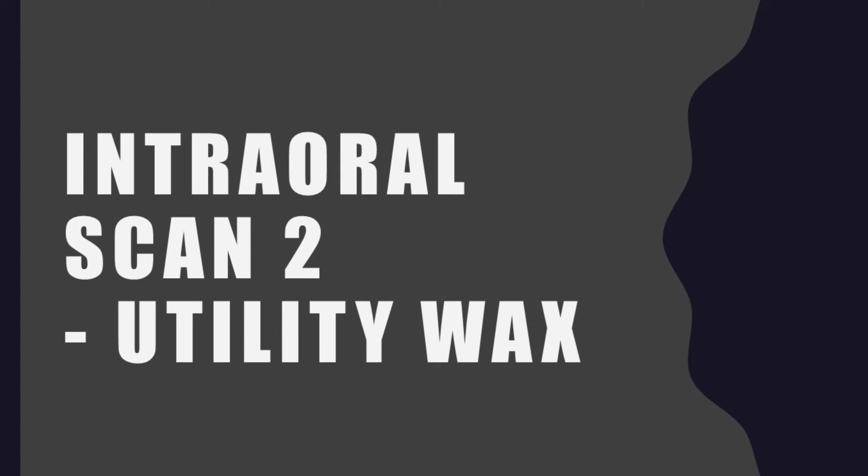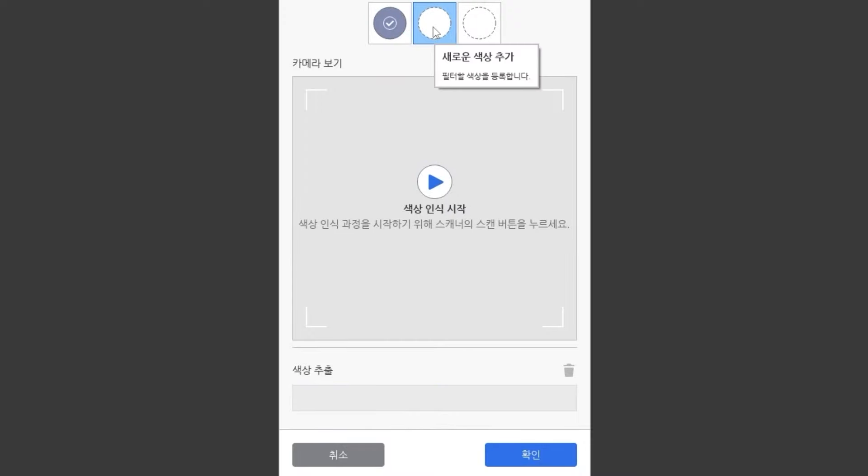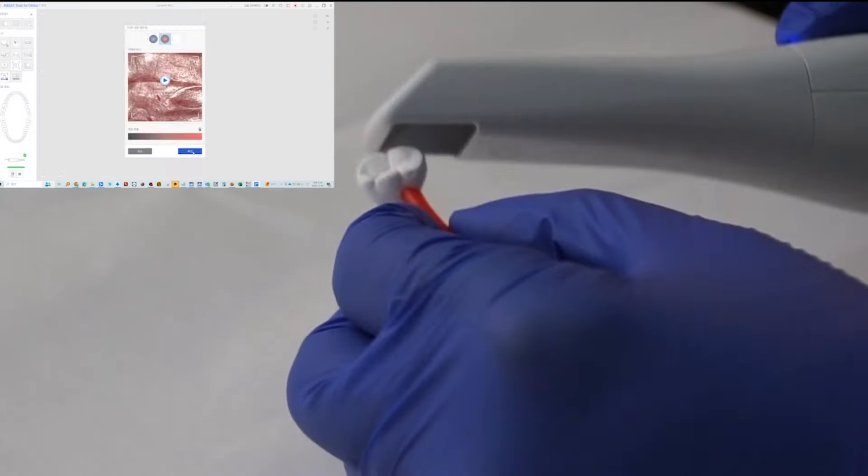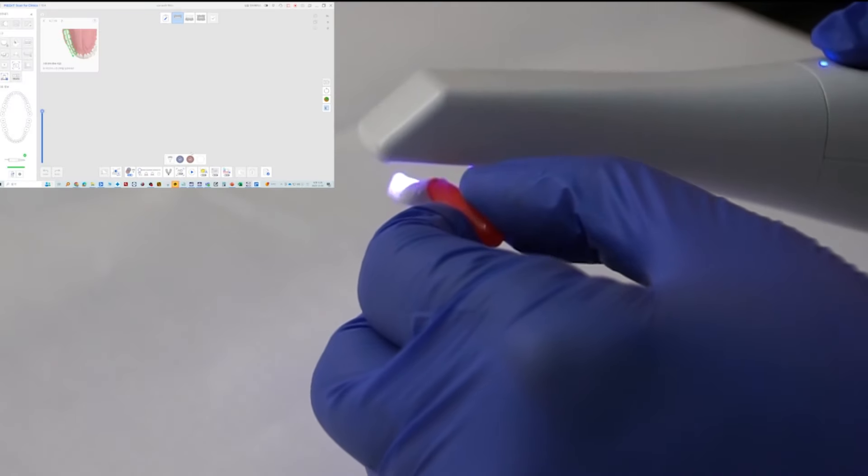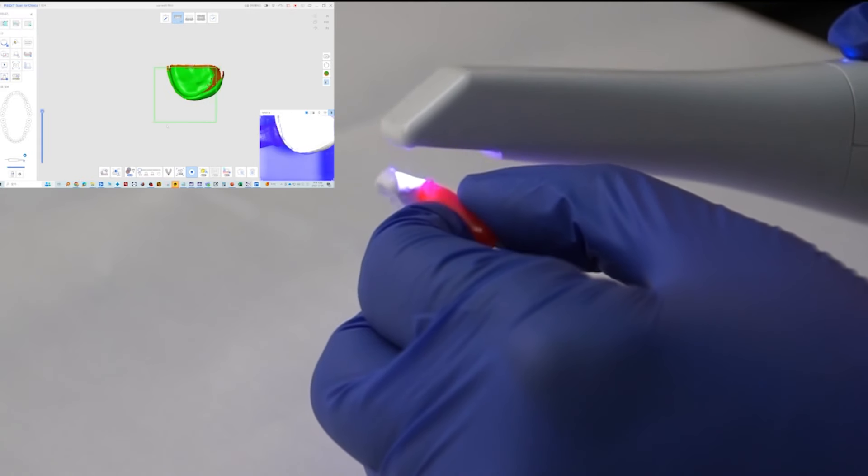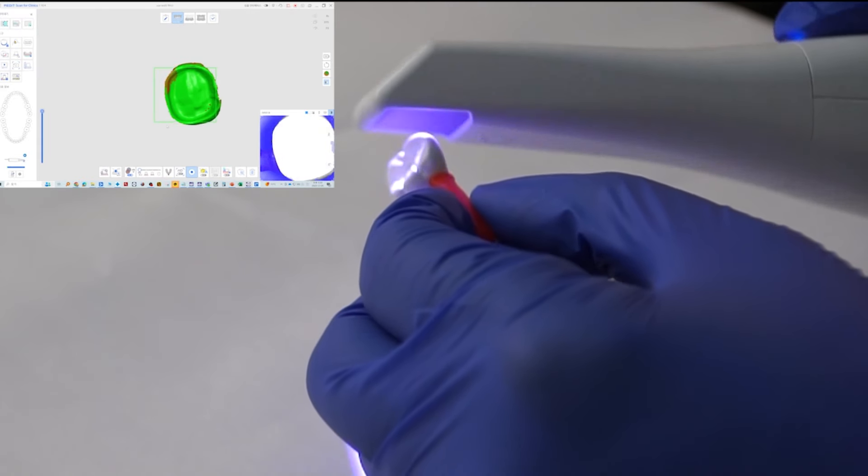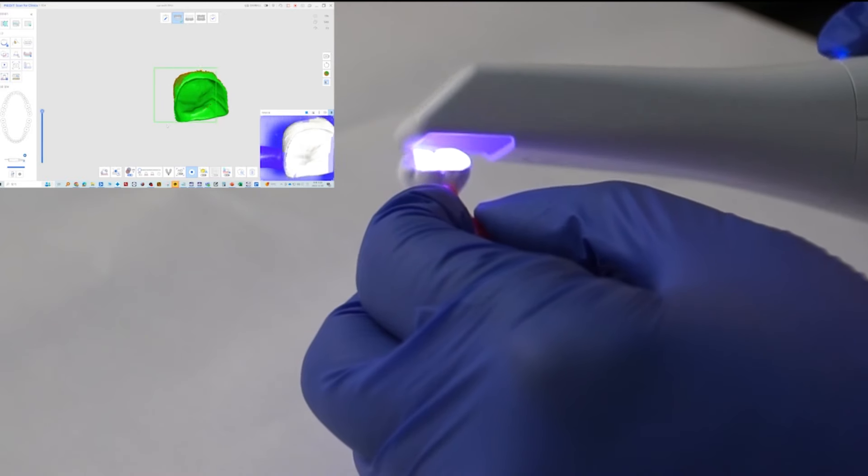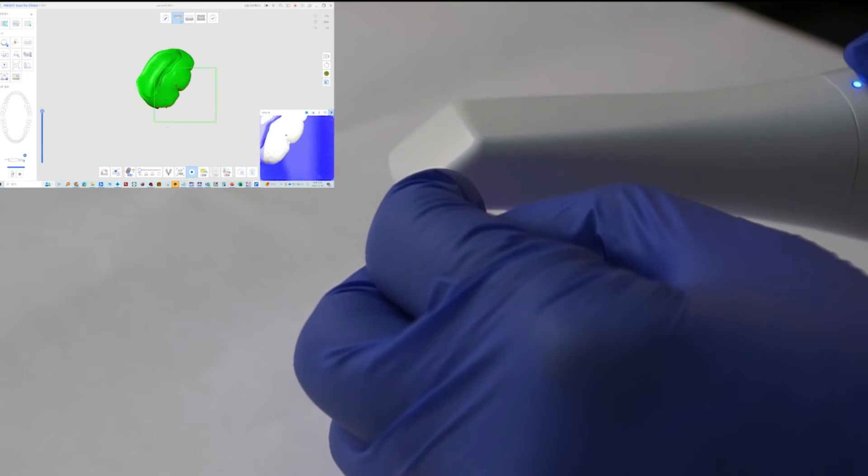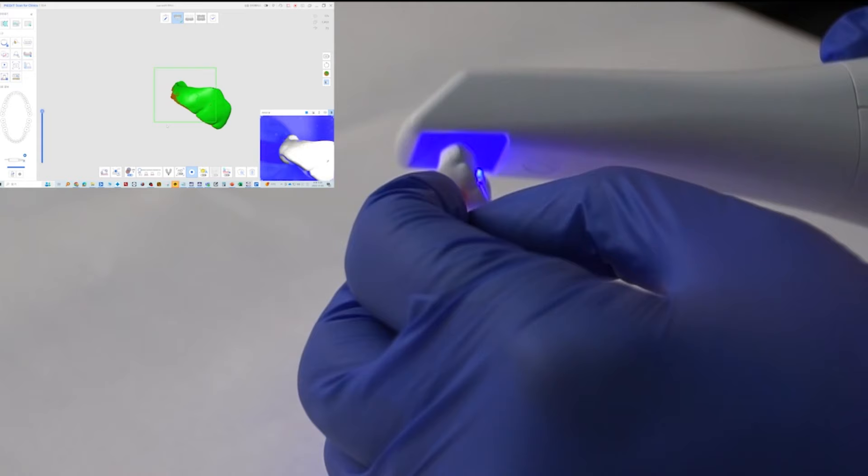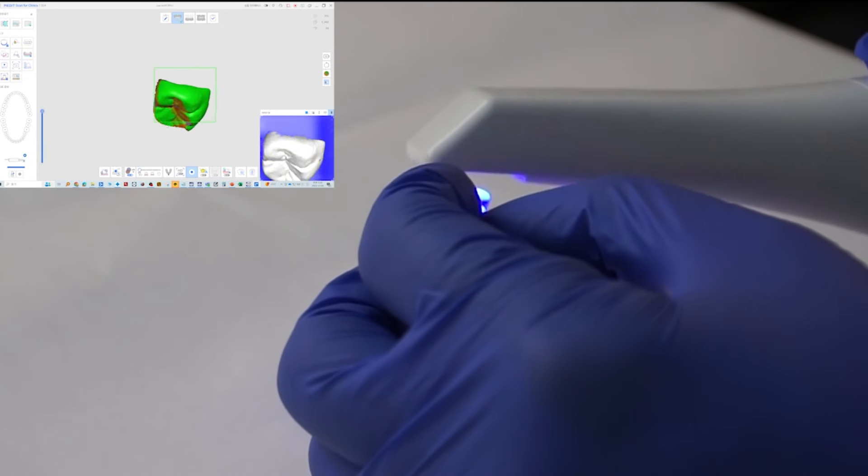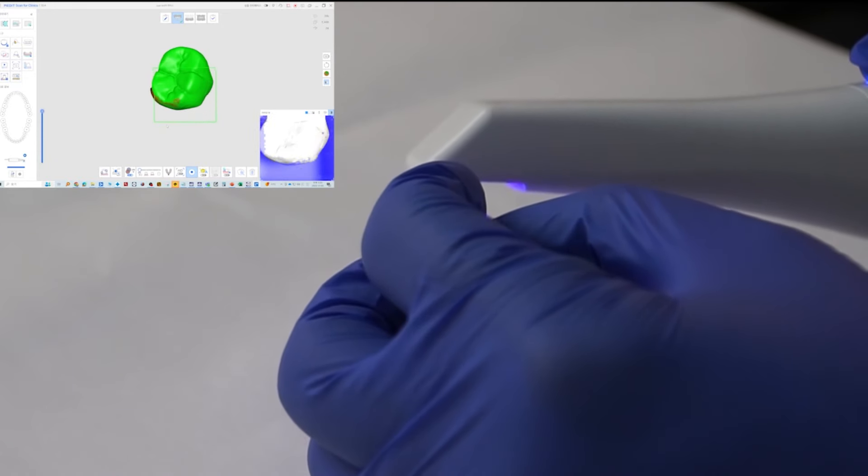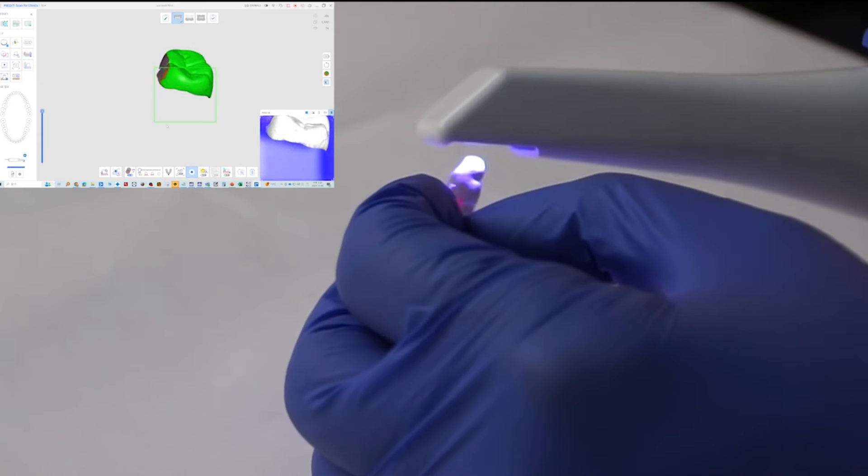Alternatively, you can stick the crown to the utility wax and scan it. Register the color of the utility wax. Prepare the wax by cutting it to the size of the scanner mirror. Scan the wax in the same way to register the color. Attach the wax to the crown and use it as a handle to rotate and scan. Reposition the wax and take additional scans of the area where the wax was stuck to complete it.